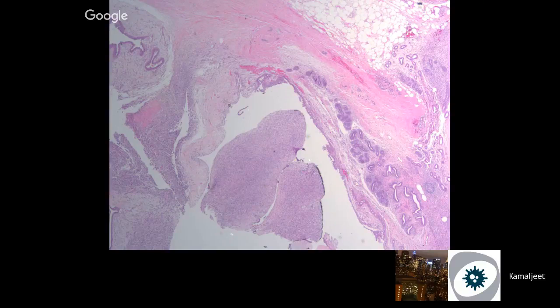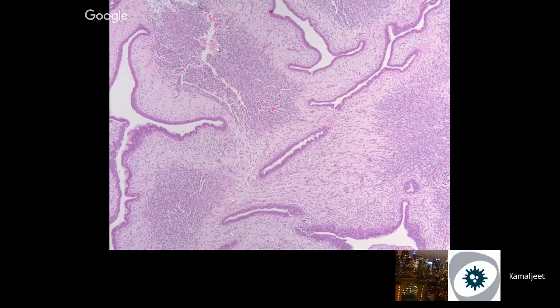So this one is a malignant phyllodes. Low power picture: it's very cellular, with leaf-like architecture, and it is permeating into the fat at this end. There's heterogeneity in the stroma, and these areas are really cellular. So basically, if you're looking at a phyllodes and the stroma looks like a low-grade or high-grade sarcoma, you're into the malignant category, borderline or malignant. One other thing in the footnote in the table is that if you have a liposarcoma, rhabdomyosarcoma, a heterologous element, it's a malignant phyllodes, no matter what the mitoses and everything else is.